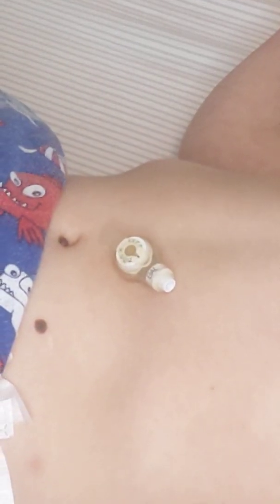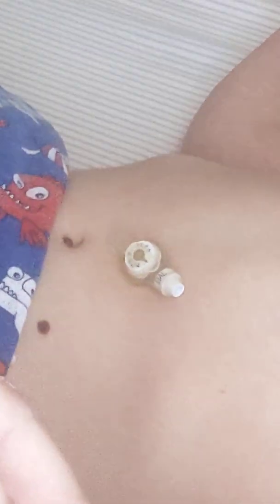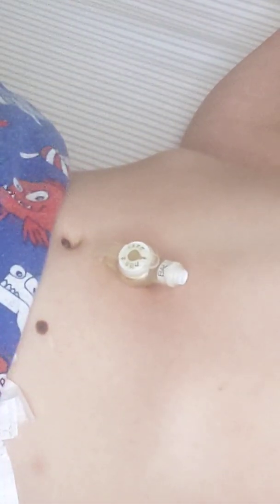Okay, so I got as close as I thought I could. First thing I do is take the little alcohol pad out, and I'm just going to clean around the button since we're going to have lots of stuff going on. A lot of times, there'll always be a little bit of discharge. That's normal. A lot of times the doctors will recommend what they call a T-sponge, which is special gauze cut to go around the G-tube.